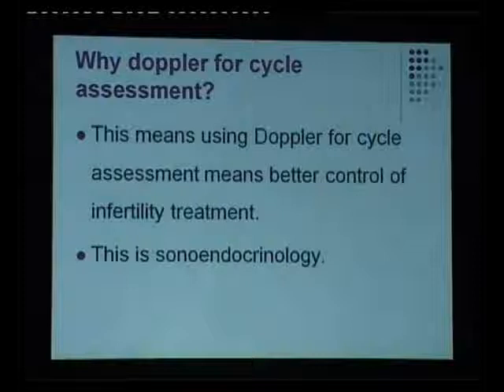With a luteinized unruptured follicle, you will have a higher RI in the range of, say, 0.5 to 0.6, with an endometrium which is echogenic and shows scanty flow, but if it's an LPD, there is an even higher RI for the corpus luteum with no flow in the endometrium, and that is the gradient of the RIs in the corpus luteum in the normal and the LPD, and likewise the gradient for the spiral arteries. So color Doppler has now become indispensable for infertility practice, and 3D power Dopplers have significantly added to the value. Thank you very much.